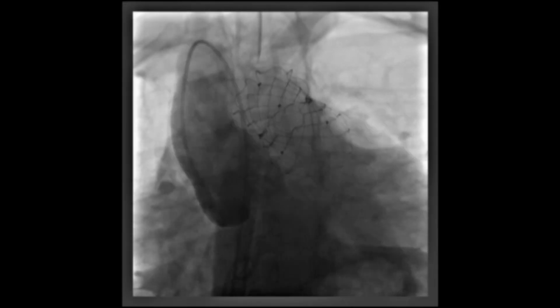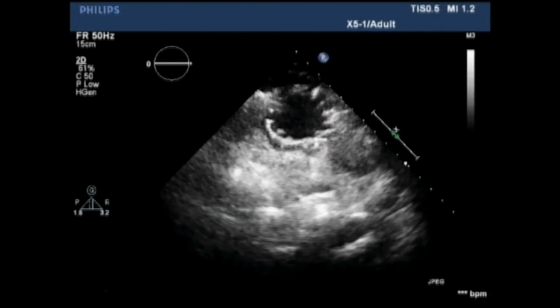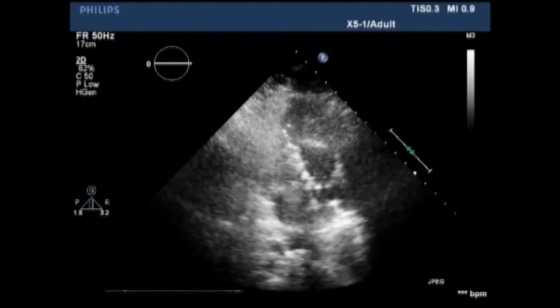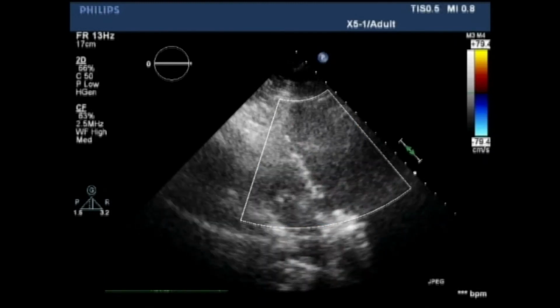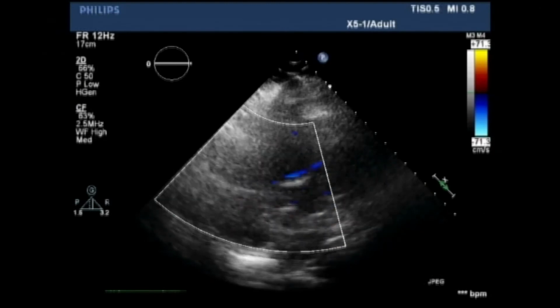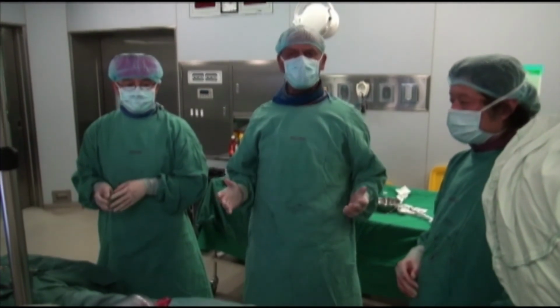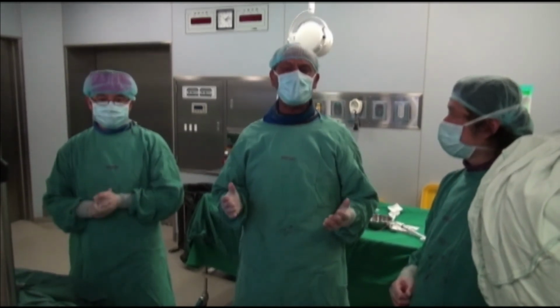And we do a coronary artery injection, determining after the valve deployment that the coronary artery is normal. So this is after the valve. I did a transthoracic echo for evaluating the valve. So we saw the valve in the right position, and the color Doppler shows in systole there is no turbulence, normal velocity, only about 1.4 meters, and in diastole, no PR. And the TR is immediately reduced. RV size is reduced.